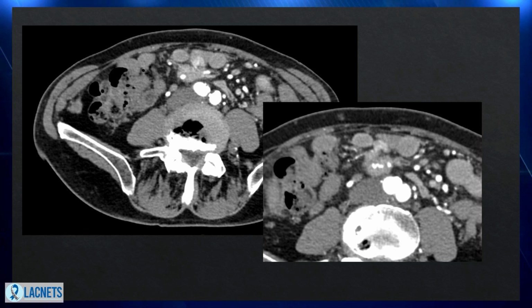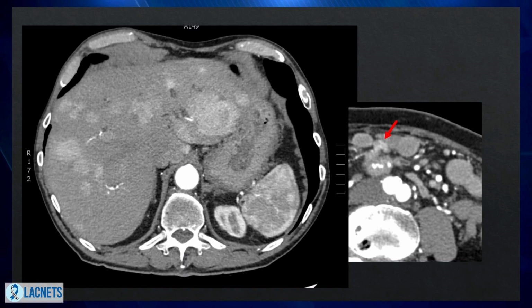The importance of detecting those early on is that even when they're so small, they could actually cause metastatic disease. This very tiny primary that we see right there in the small bowel has already metastasized to the liver, and look at how many liver lesions there are. So that's why small bowel neuroendocrine tumors are tricky, and they could go undiagnosed for a certain period of time before they get larger or metastatic, and then they're obvious at that point.